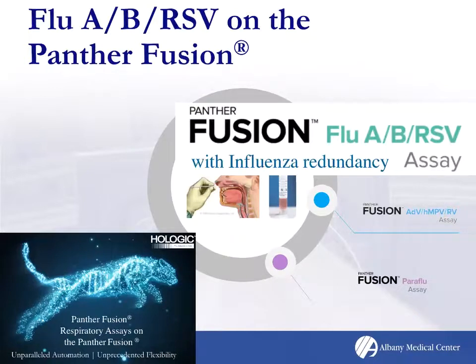They have a Flu A/B/RSV assay, an adenovirus, metapneumovirus, rhinovirus assay, and then a paraflu assay. But I'm just going to be focusing on the Fusion Flu A/B/RSV assay and its influenza redundancy, because they designed their assay so it amplifies 2 target regions and uses multiple probes to capture more strains of virus.